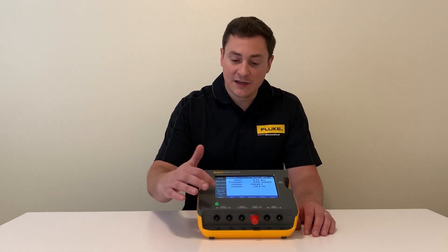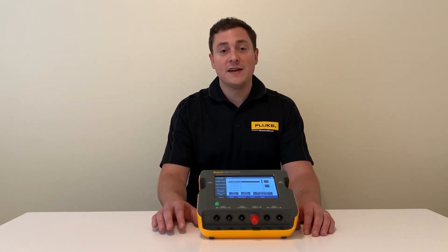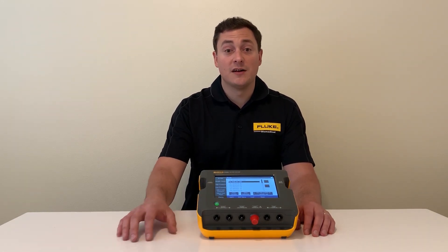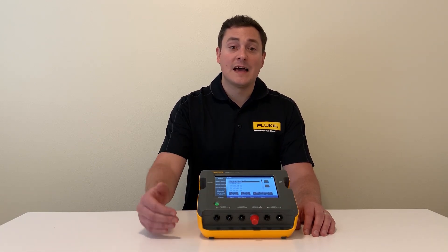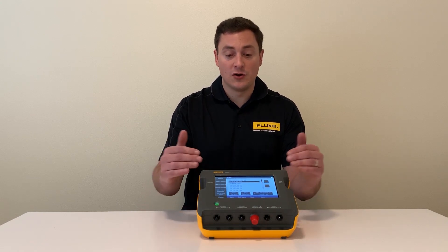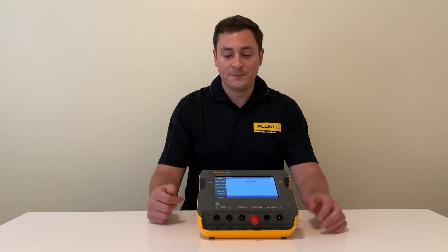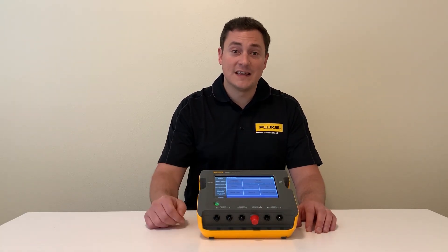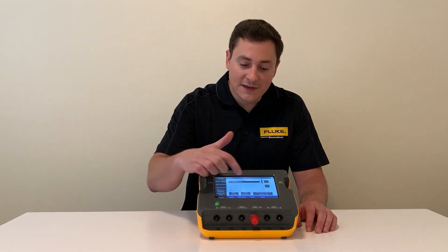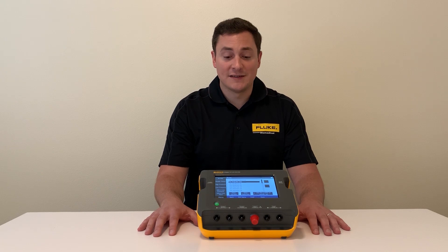The second innovation is test profiles. If you think about your service manual, there are many things that are specific to that brand and model of ventilator. You can program them all into your test profile — gas type, correction mode, units — all of that can be saved so that when you show up to your ventilator, you press load, make your connections, and you're ready to go. You can even save the load part by setting it to load at startup, saving time for every unit you test.